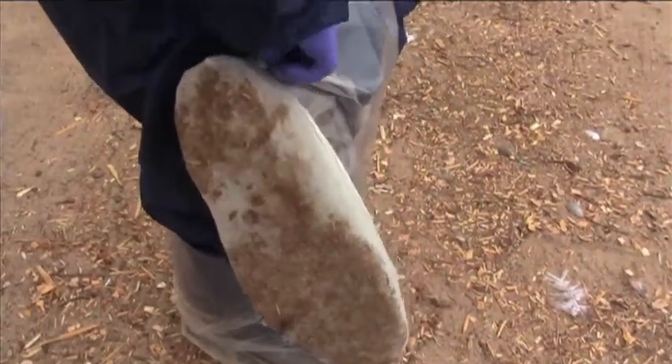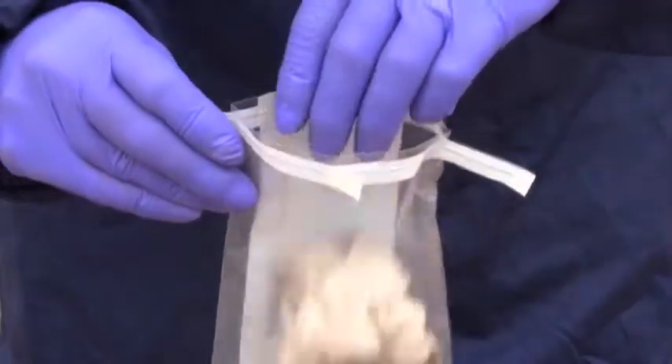After collecting a sample, place the Envirobooty back into the sterile sample bag and send it to the lab.